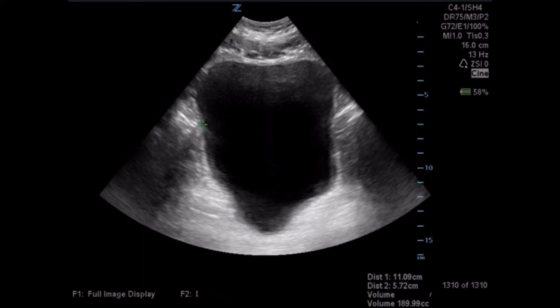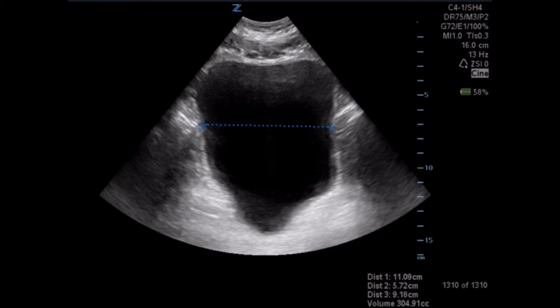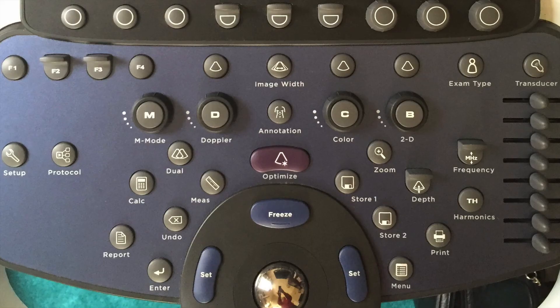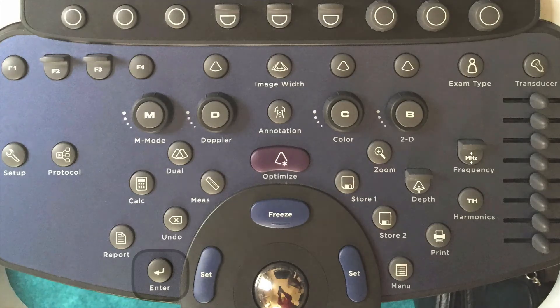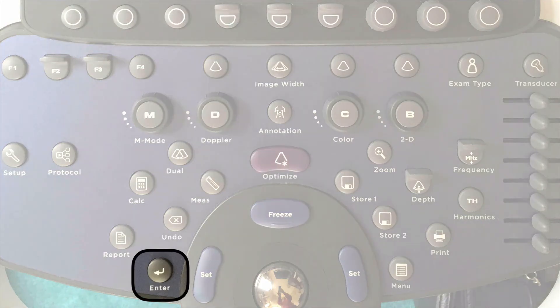We're now going to measure the lateral edges of the bladder to lateral edges of the bladder, using the same function of the set key and the trackball. Once we have that third measurement, you can see the total volume is at the bottom — in this case it is 304.91 mls or cc's of fluid. You do want to press enter again to lock that third measurement into the calculation package if you use automated reporting.